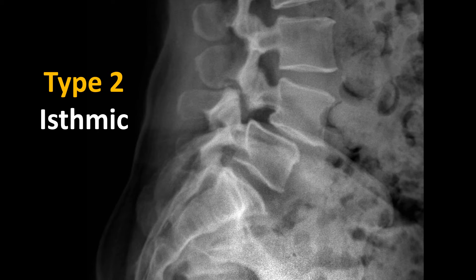Here is a radiolucency extending through the pars and an anterior translation of L4 in relation to L5. The spinous process remains where it should be, but everything else has moved forward. This is a classic appearance of a type 2 isthmic spondylolisthesis. The most common type of stress fracture in the spine is a pars defect. L5 is the most common area, followed by L4, L3, L2, and L1.